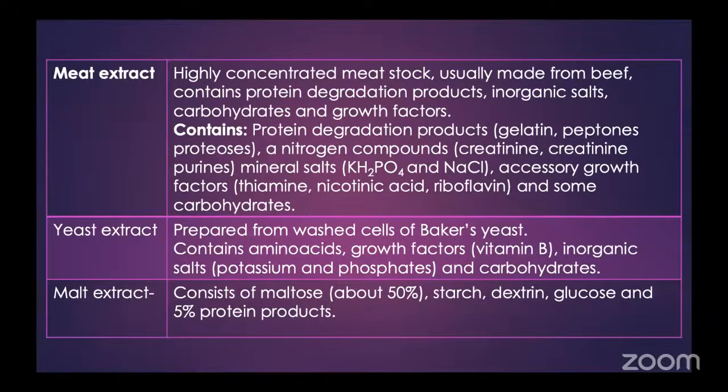So then we come to the meat extract. Now, what is a meat extract, what is yeast extract, and what is malt extract? You will find that these are given only in the older book of Mackie and McCartney because the majority of labs and institutions now use ready-made media. So we don't actually require these, but you should know as a PG student where they come from.